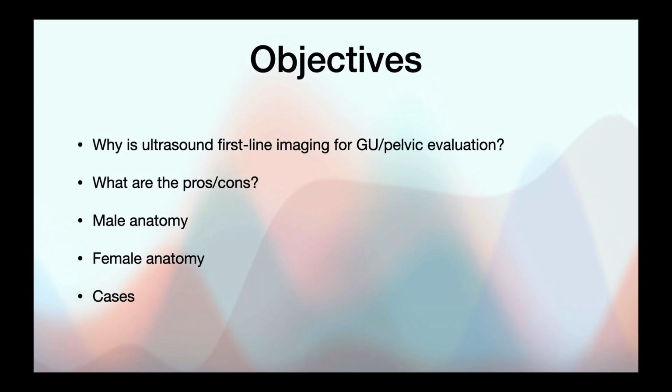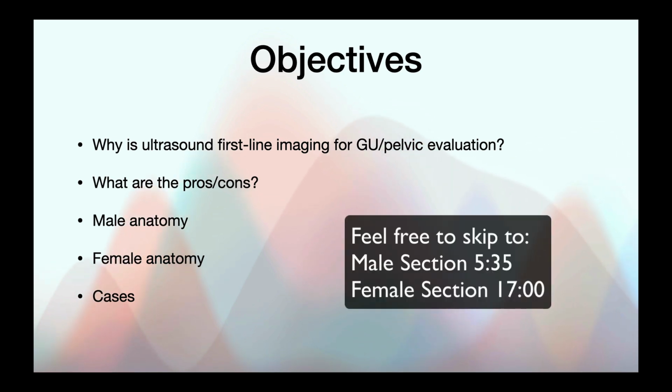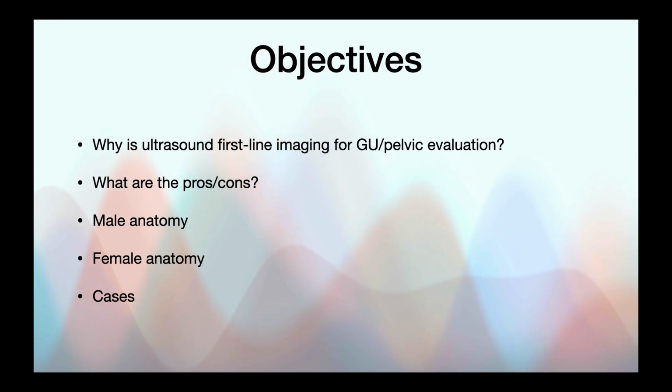So, let's get started. In this video, we will discuss the advantages and disadvantages of ultrasound, the normal anatomy and the basic technique of ultrasound, and its use in the evaluation of these common clinical presentations.